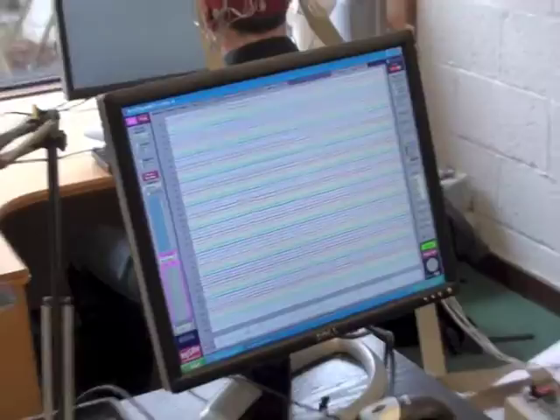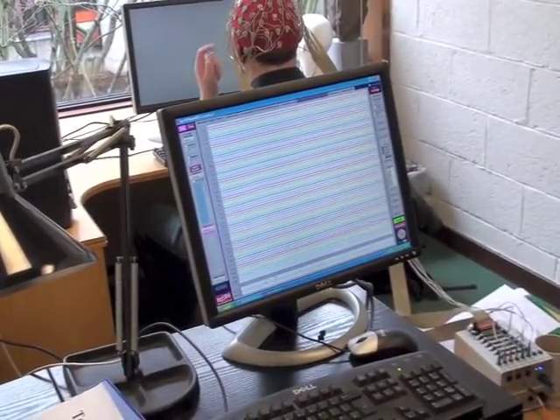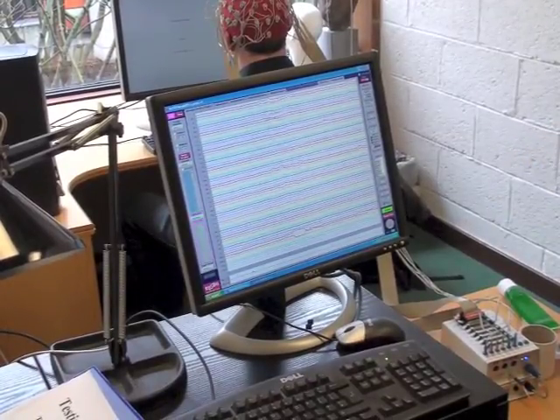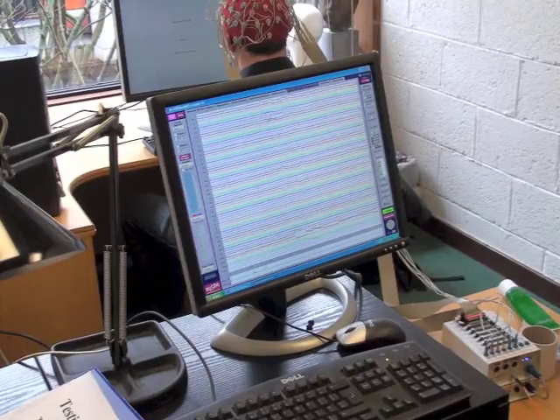Okay, so it's like a time log almost. And whenever there's an immediate repeat, it would say 250, and Bren presses space bar there. It will say 50 whenever he's pressed the space bar. So later on when I go to analyse the data, I can say whenever there was a 50 response, just take away that bit of data, as well as take away his eye blinks and whatnot. Okay, because you're monitoring or analysing his behavioural responses totally separately? Yes. I don't even care about the behavioural responses.